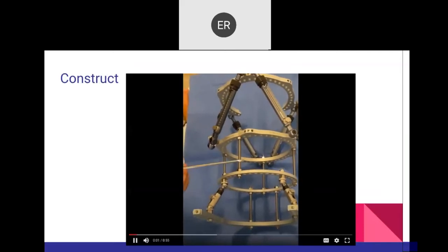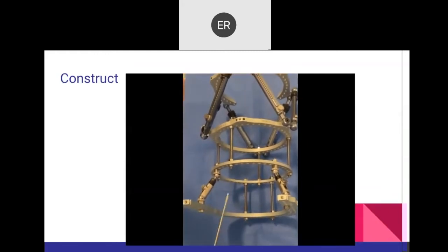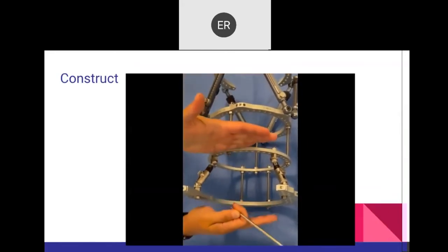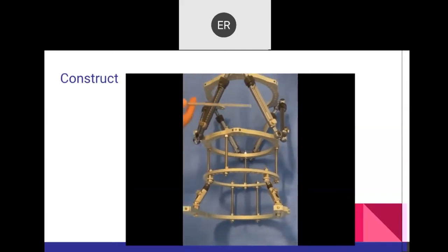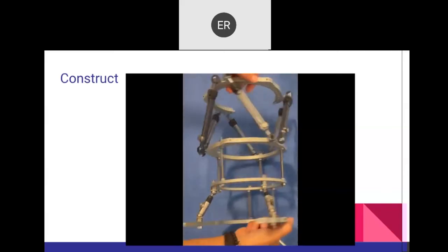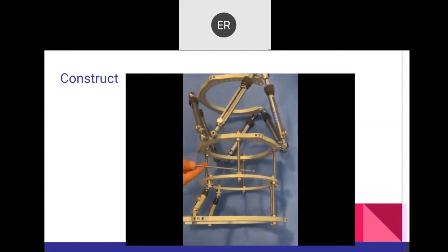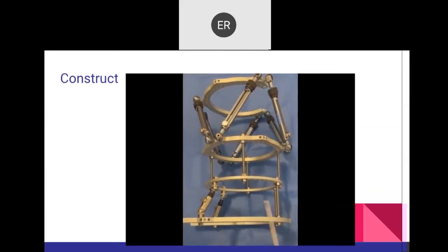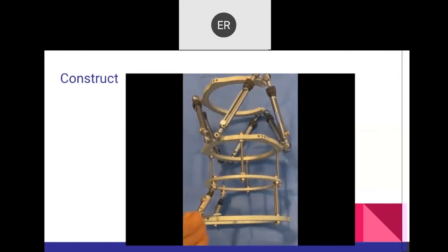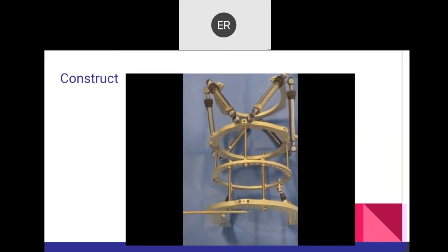From an orthoplastic standpoint — managing soft tissue and bone defect — if you have a bone defect in a specific area, that area will compress with the soft tissue envelope, and then you restore the length on the proximal segment. The frame has four threaded rods on the lengthening block for AP and midline stability, struts anteriorly on the foot support for wire placement, and two threaded rods posteriorly for stability.